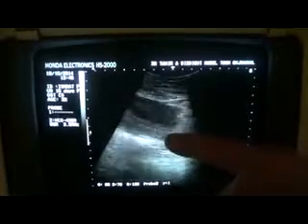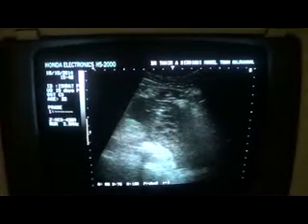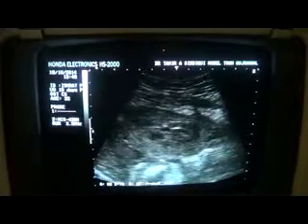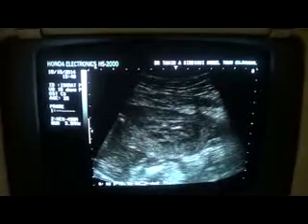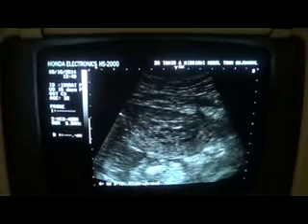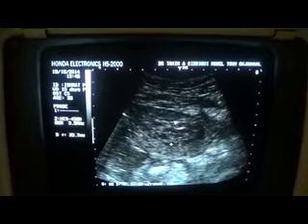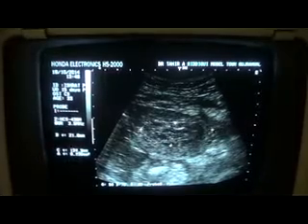This is the cervix, and again this is the endometrial canal. Now we are seeing this in longitudinal section. Let's see in transverse section. Let's magnify a bit. Now you can see that there is multiple layered echogenic material within the dilated endometrial canal with fluid. This part is the fluid, and the rest are the echogenic areas within this dilated endometrial canal, something around 23 millimeter from this angle, scanning plane.